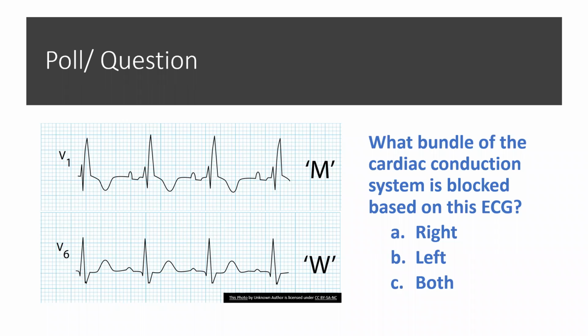Whenever you have a bundle branch block or suspect a bundle branch block, you always have to look at the 12-lead ECG. In particular, the ones that will help you quite a whole lot would be lead V1 or V6. Now, if lead V1 shows you an M pattern, as illustrated here, meaning that it is going to be upright like this, this is going to be a manifestation of a right bundle branch block.